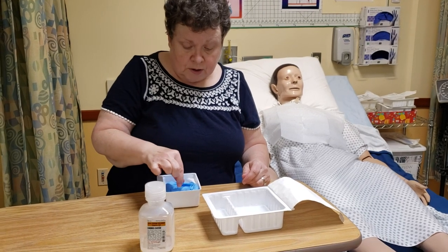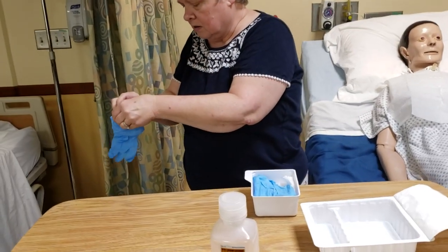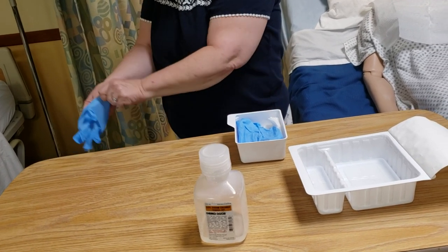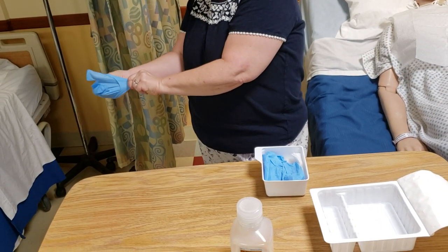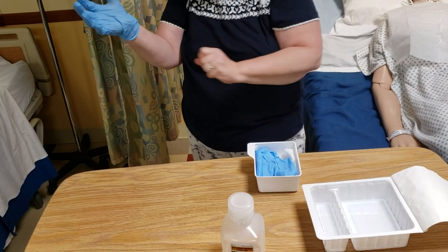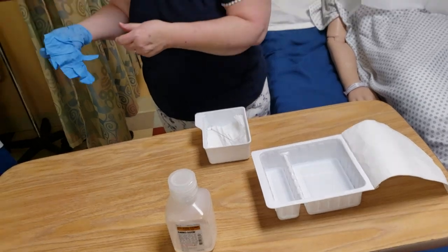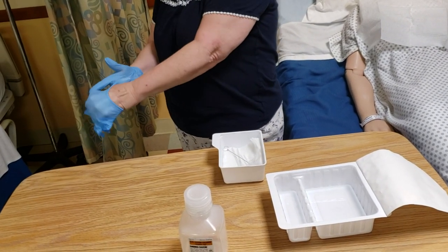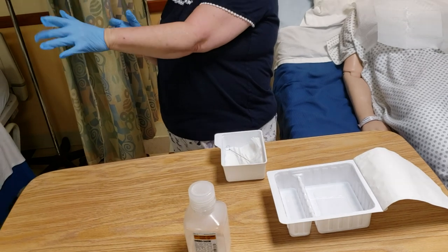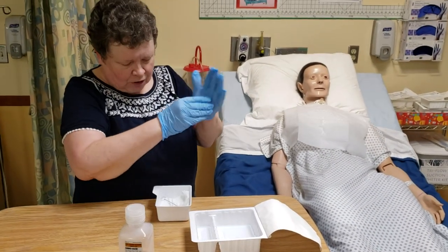These are sterile gloves, so I'm going to attempt to get them on my sweaty, larger hands. Even if you're nervous and sweaty, you can get them on.